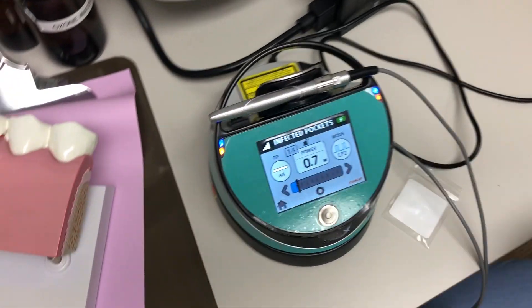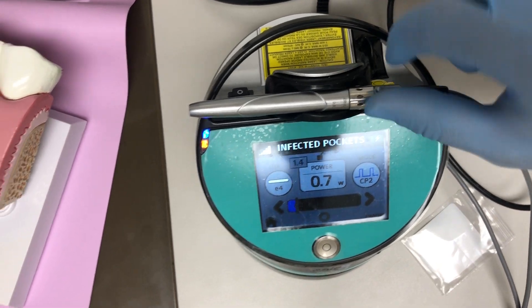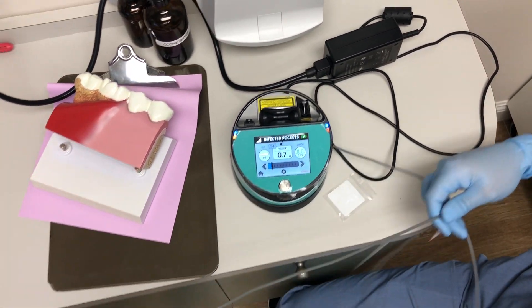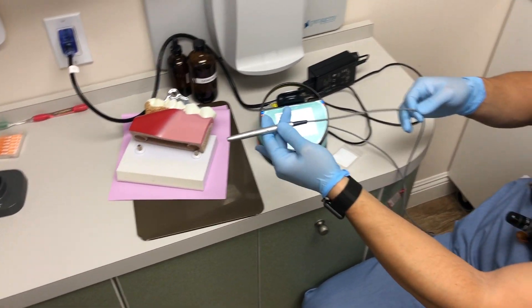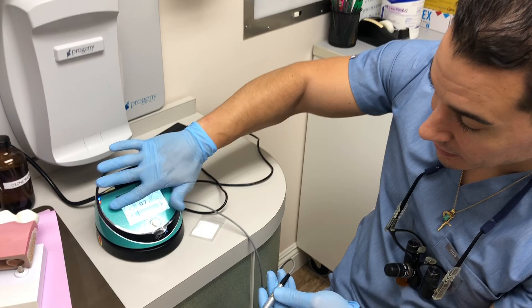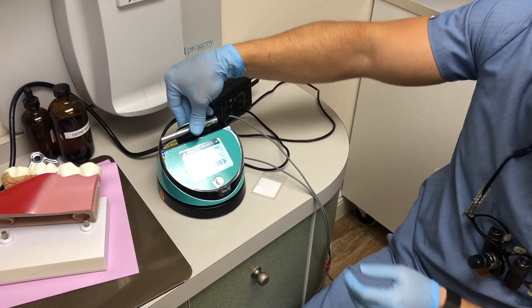The handpiece is cleaned — wiped with Cavicide. Use a Cavicide wipe to clean the outside surface and any of the cord that you may have touched, but be gentle — don't push on it too hard. Just gently clean around it all, clean the unit and anything you might have touched. It is ready for the next patient.